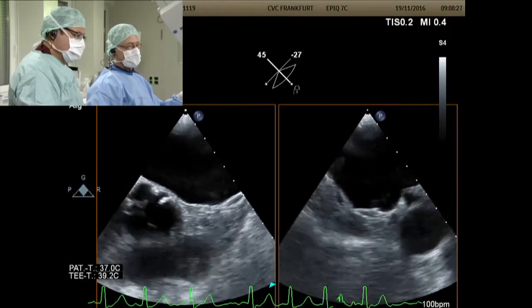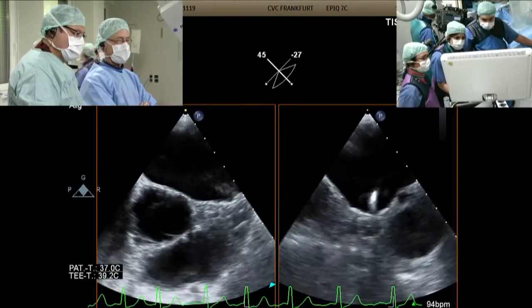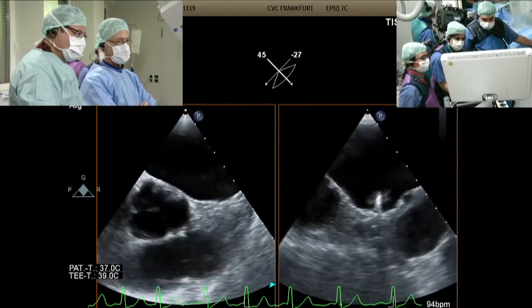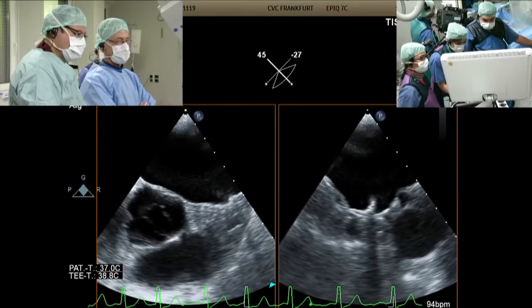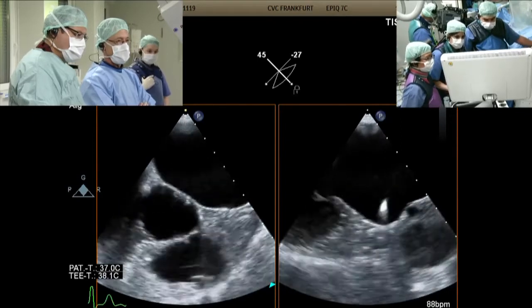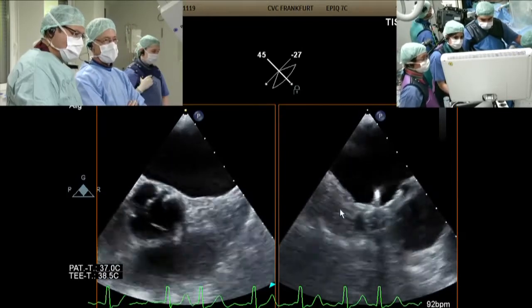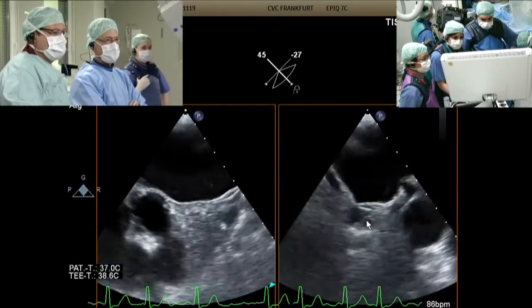Sorry, Bushra, I can't hear you. What were you saying? See the gap. The gap is there where the lobe, the inferior lobe, isn't covered. I'm just going to scroll back and see if I can show it to you. So you can see the gap here. Yeah. We're not quite angled enough because we're struggling in the 135 view to show an image, because you can actually see there's a gap here which looks a few millimeters and you can see flow around the edge of the device, but we can't quite see it in this view here. But I hope you can just about see it coming and going here. And it shows the flow as well.